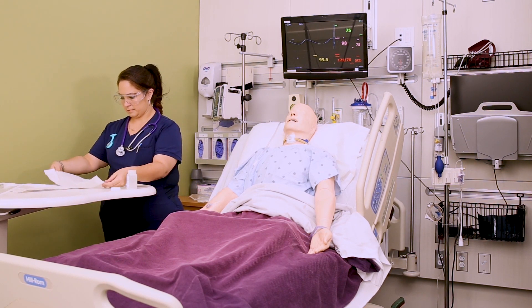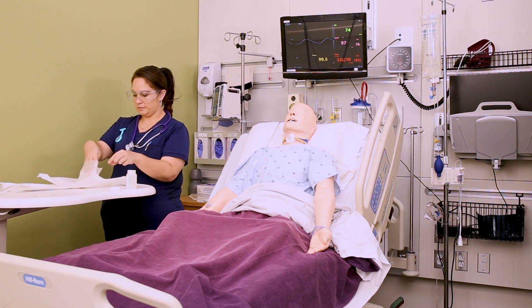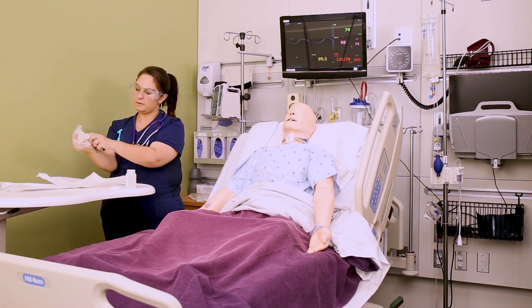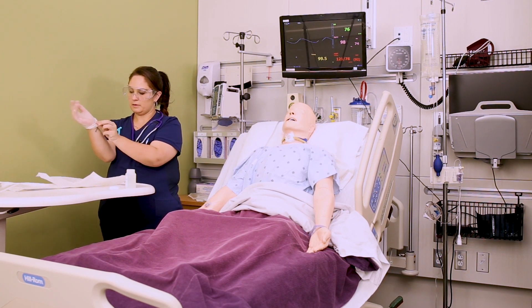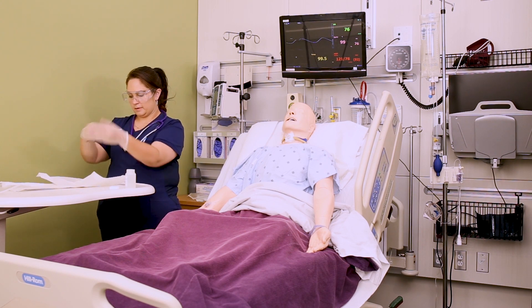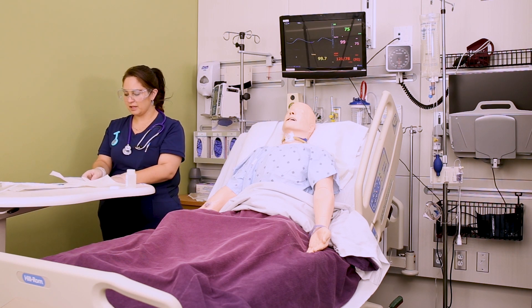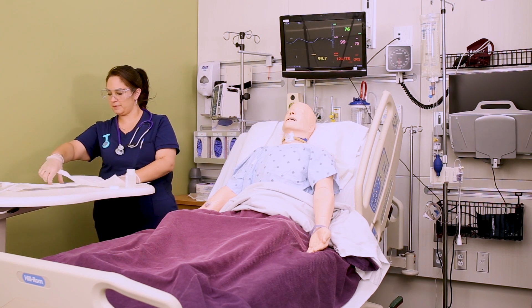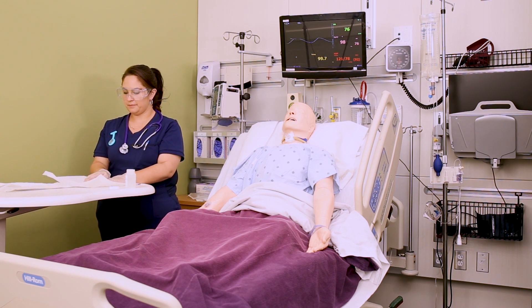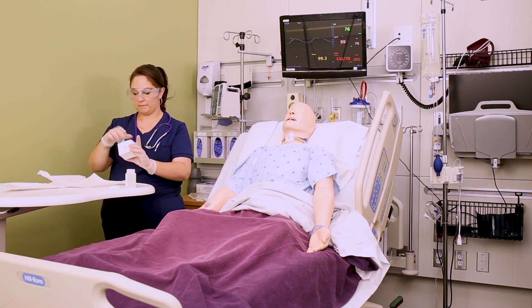In this little kit what you should have is the sterile gloves, the suction tubing, the suction catheter itself, and a little cardboard water container. Once you get your gloves on you want to open that little cardboard water container inside the sterile package and set it up on your sterile field. Sometimes if I get another package of gloves I'll actually use the sterile gloves package as my sterile field.